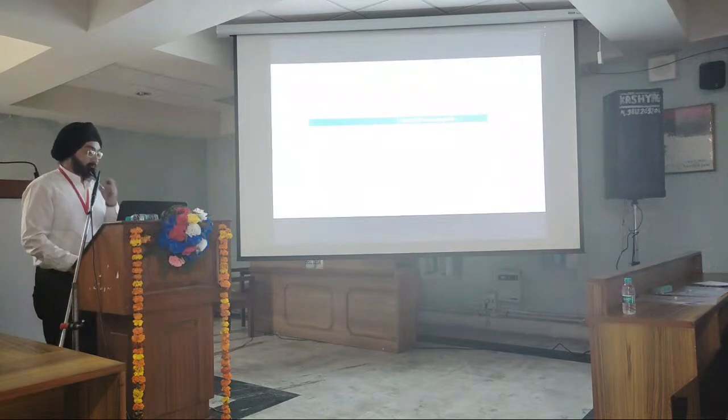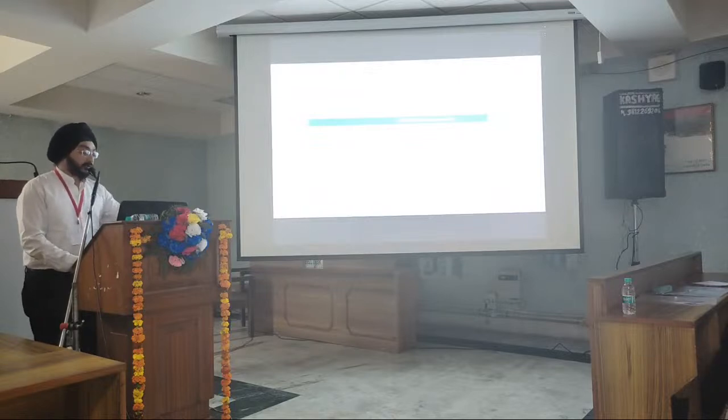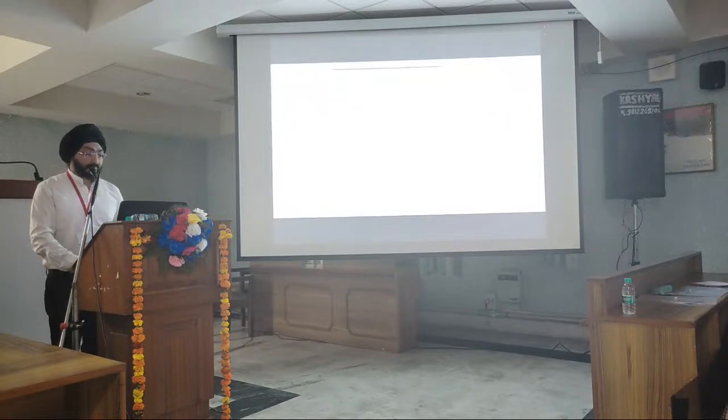So this was one meta-analysis which was done by our center, in which we evaluated the role of PSMA PET-CT to detect prostate cancer in cases of suspected prostate cancer, and it was concluded that gallium PSMA PET, on the basis of available literature, has excellent sensitivity and negative likelihood ratio for the initial diagnosis of prostate cancer in patients who have a suspicion.